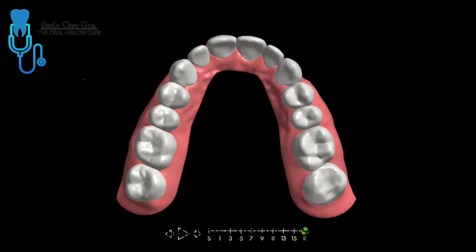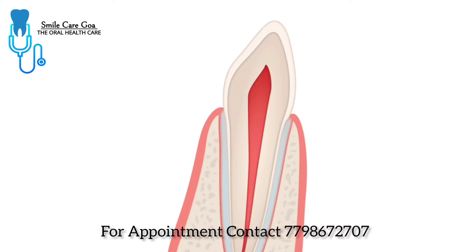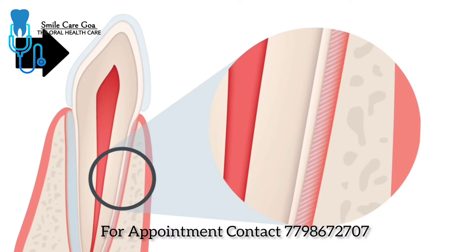Let's take a closer look at how this works. Each tooth is surrounded by a periodontal ligament. This ligament is surrounded by fluid and tiny fibers that connect the teeth to the surrounding bone. As soon as the aligner is put on, it immediately starts applying pressure to the targeted teeth. The fluid in the periodontal ligament prevents the tooth from moving at first, but within a few seconds, the fluid is expressed from the area.